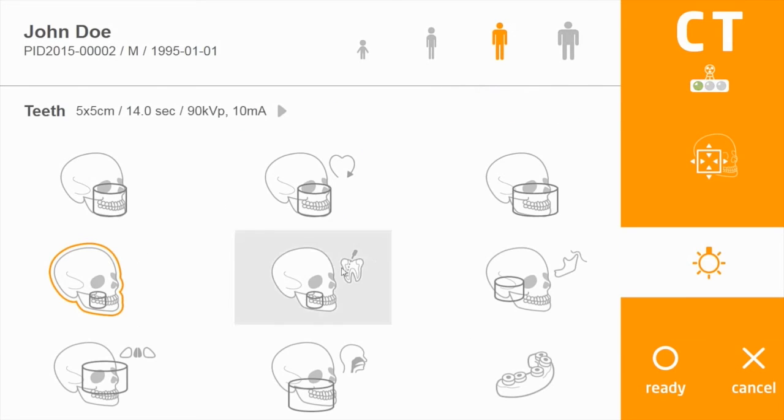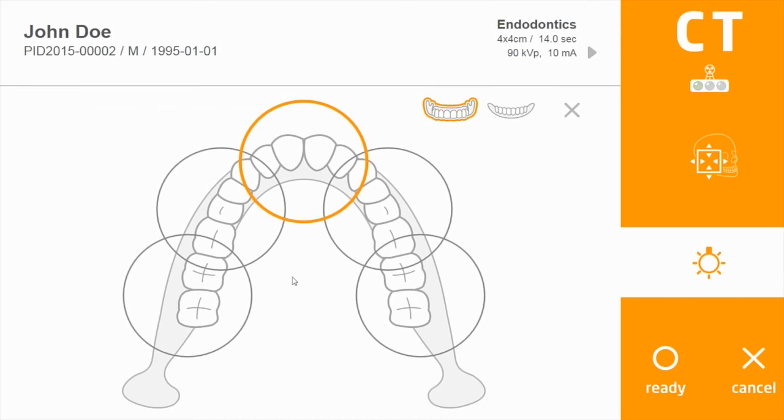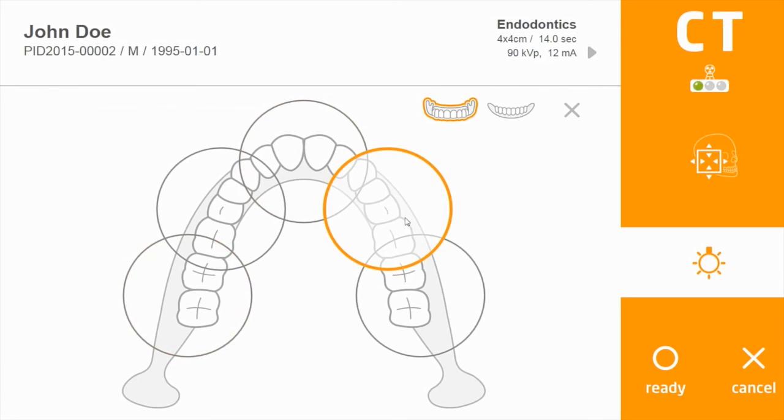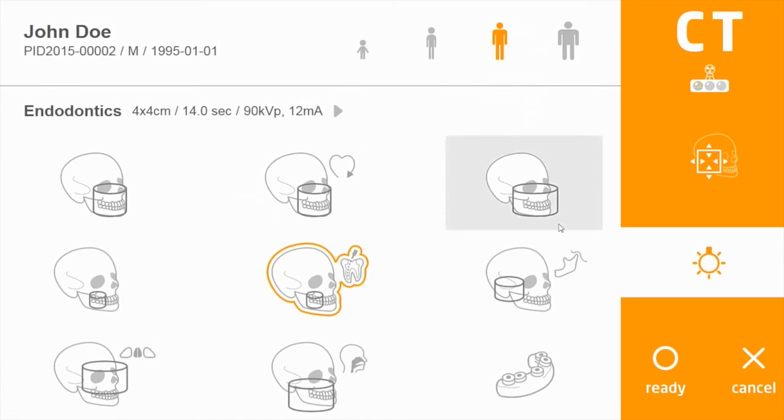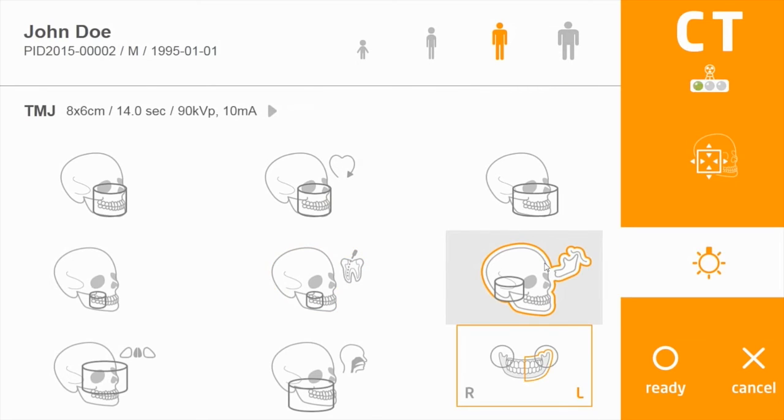The next option gives the highest resolution at 70 micrometers with the same concept as before. To the right of that is scanning a single unilateral TMJ.